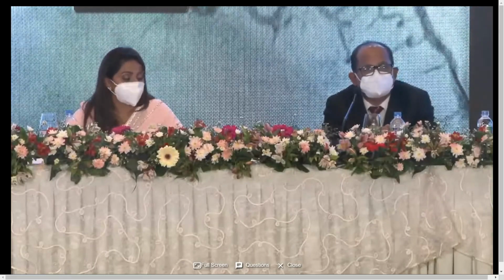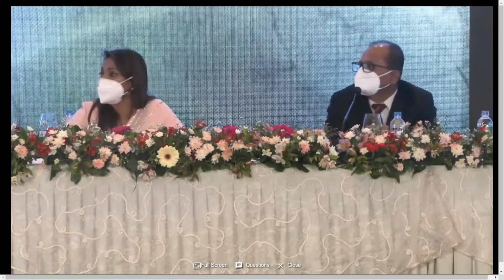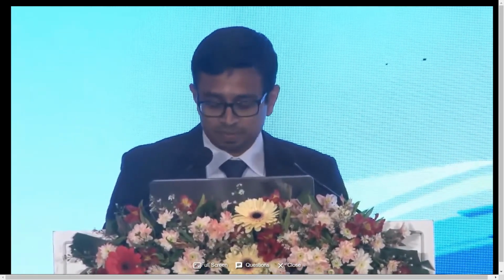So as you say, it could be a culotte or a DK crush. Yes, I appreciate that. I think we should go ahead with the culotte technique or a DK crush in this upfront strategy. So, madam, would you like to add anything? So having decided to go ahead with DK crush, the operator decided to wire both the main vessel as well as the diagonal.